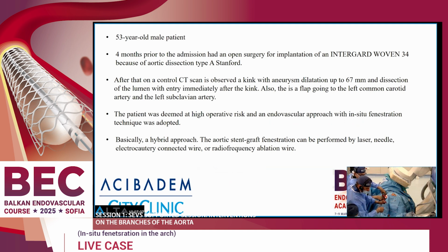So basically, this is a case of hybrid approach treatment of a patient with type A Stanford dissection, treated firstly with an open heart surgery, and after that, because of an extreme kink with aneurysm dilatation directly after the implanted interposition graft, we are going to do an endovascular only treatment with in situ fenestration, because the patient is deemed at high operative risk, and another cardiac surgery would be very high risk for his life, and that is why the endovascular technique is adopted.